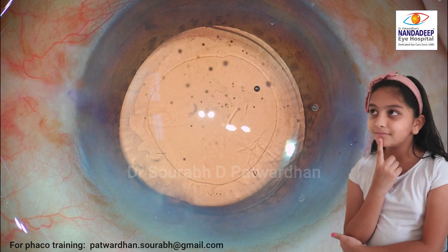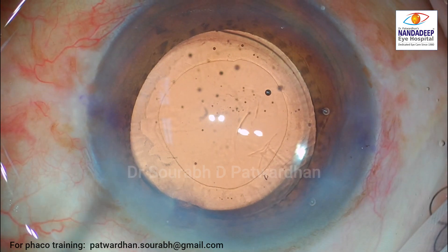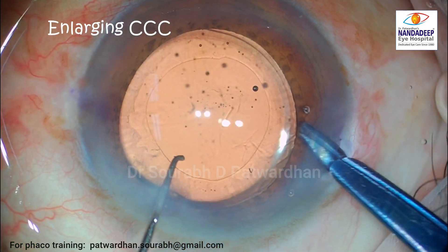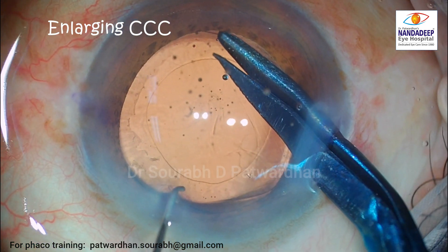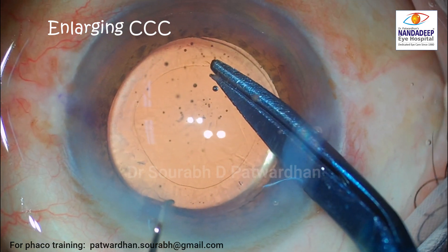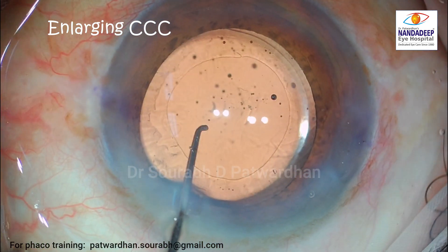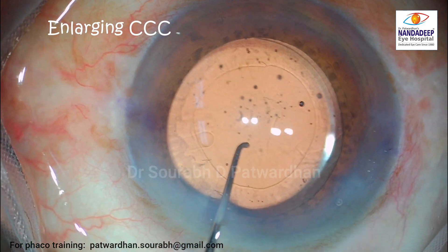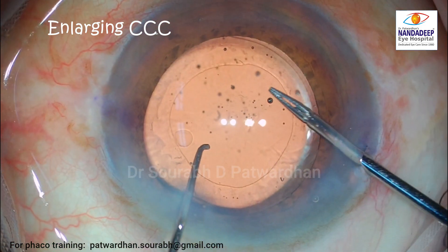Let's find out what we can do to make this surgery even better with the finishing touches. With pseudo exfoliation, it's better to avoid a smaller rhexis. In this case, you can see the rhexis is around 4 to 4.5 mm. I want to enlarge it to around 5 to 5.5 mm. I use a Titanium Vannas to make a tangential nick — remember, a tangential one, not a radial one.